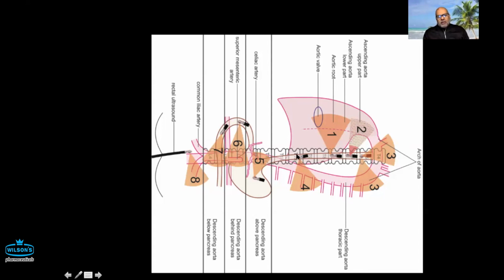And the heart, when you come here, the heart lies anterior. So when your heart is lying anterior, and if you're moving the scope clockwise, it's actually moving to the right of the patient. And when you're moving it anti-clockwise, it's moving to the left of the patient. Now this will help you. I'll bring it all together and show you a movie also. So, but keep that in mind. So the anatomy actually is like this when the patient is lying in the left lateral position.